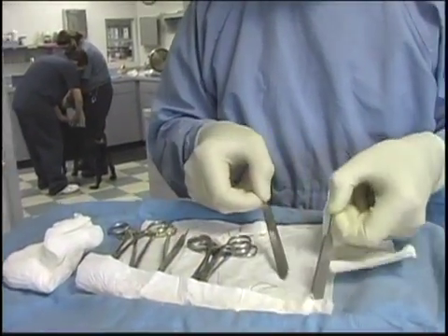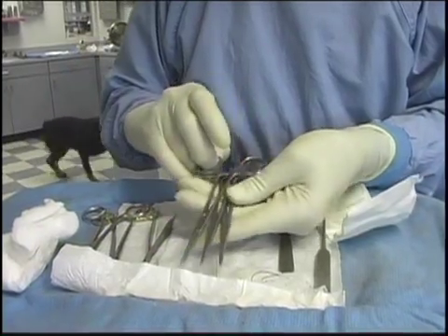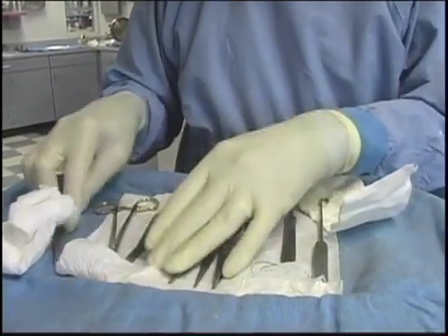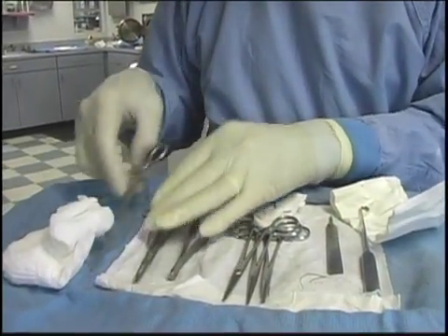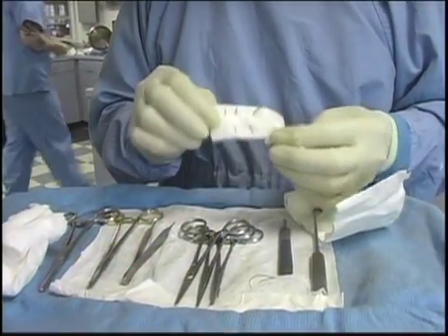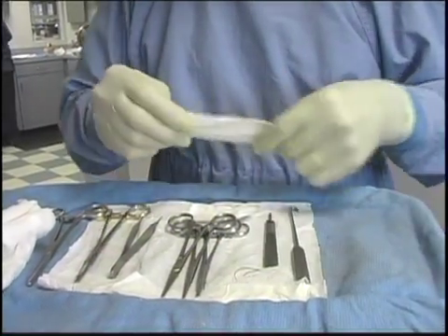Spay hook, scalpel, three crile-straight instruments, thumb forceps, needle holder, Olsen-Hegar — they have the scissors in them — and a carmalt for larger tissues. And we have the suture needles, so we can make a choice of what ones we want.